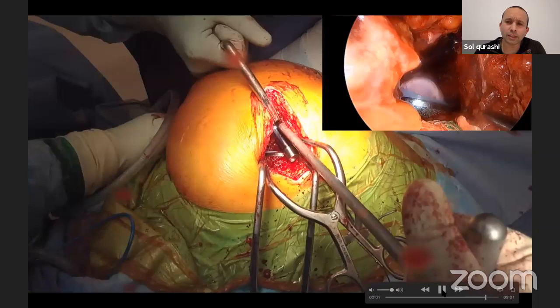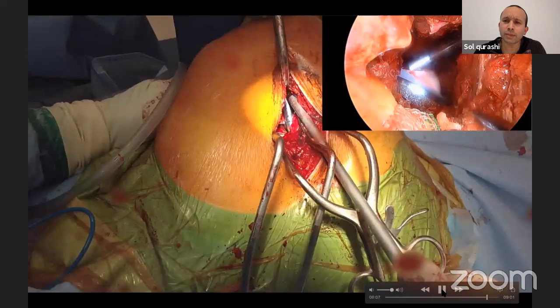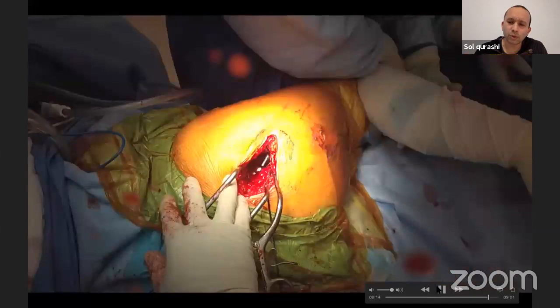Pull, internally rotate a little bit until it lines up. Okay, release traction and you're in, okay? So that's the in-situ reduction.